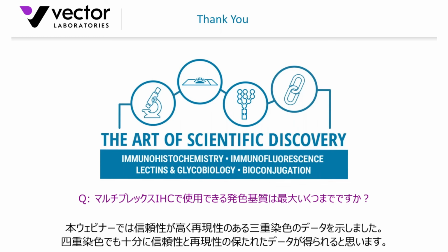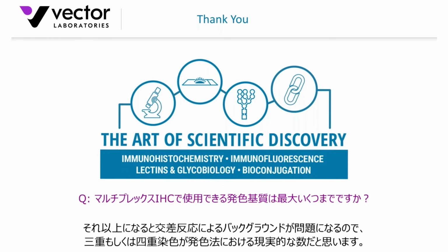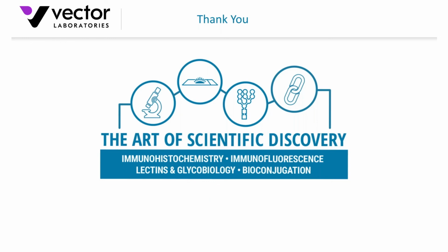I would say that probably maximizes what you could do with chromogenic staining for reliable, reproducible, unequivocal staining. I think more than that, and you may start to run into some background problems with cross-reactivity. So I'd say certainly 3 or 4 would be a key target that you'd look for successful multiple antigen labeling using the chromogens.